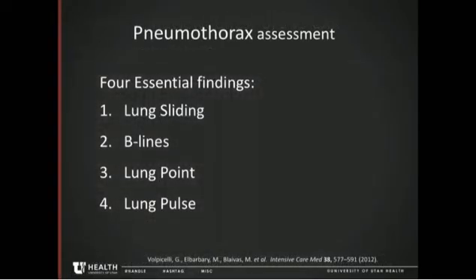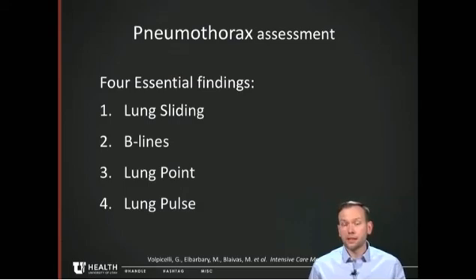So now I'm going to talk a little bit about the pneumothorax assessment by lung ultrasound. And many of us are aware of lung sliding. But fortunately or unfortunately, as we've been doing research into diagnosing pneumothoraces, getting that high sensitivity and specificity that we need, we actually need to look for at least 4 different findings, which I'll lay out for you in detail. And I'll show you how to navigate those findings in a diagnostic chart that allows us to essentially generate a pathway for the diagnosis or exclusion of pneumothorax.